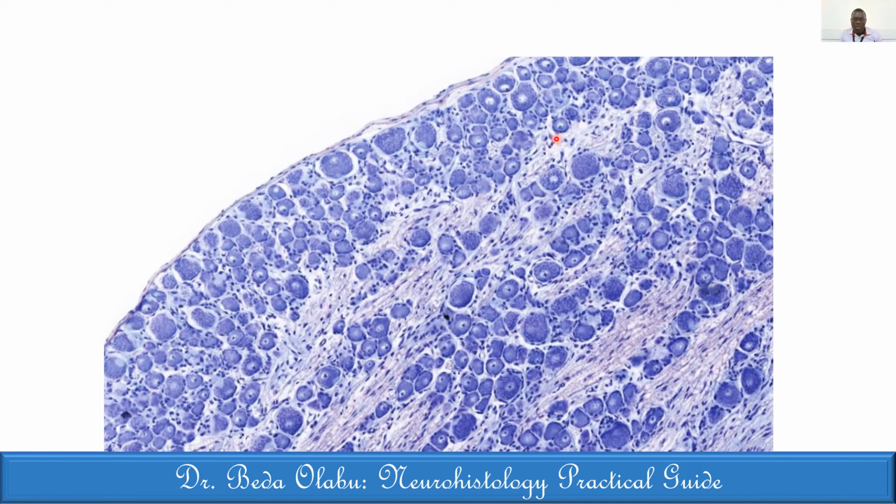A very prominent nucleolus. Remember, the nucleolus produces ribosomes, or at least ribosomal RNA. So again, that is consistent with a cell that is actively synthesizing proteins. These cells are large, many, grouped together, and they have a feature of active protein synthesis and secretion. That is one of the unique characteristics of neuronal cells. Usually neurons have that kind of property.